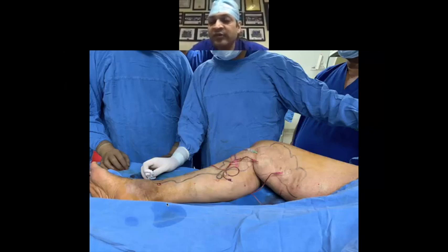The other way is you put in the scalp vein, and then you can see the green needle. I'm giving the tumescent anesthesia all around these veins and making these veins compressed of the blood, and the blood will start coming out of the scalp veins. And then I'm going to flush these scalp veins and make sure that when I flush any scalp vein, the saline comes out of the other scalp vein. So it means I have actually washed out the blood from these varicosities.